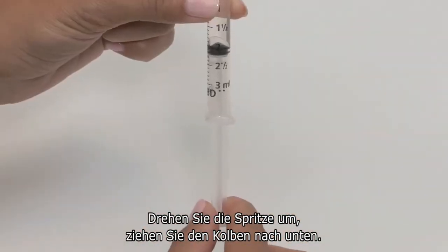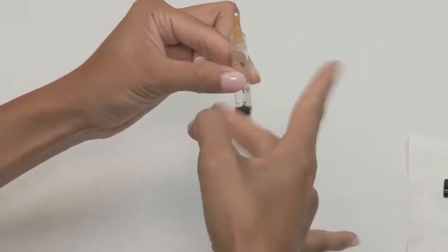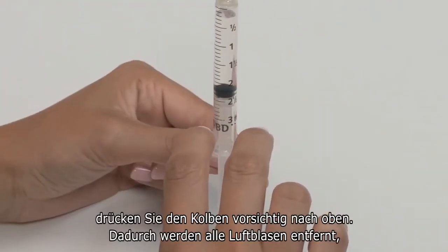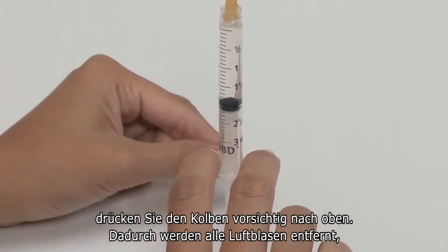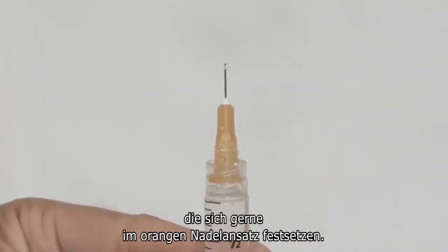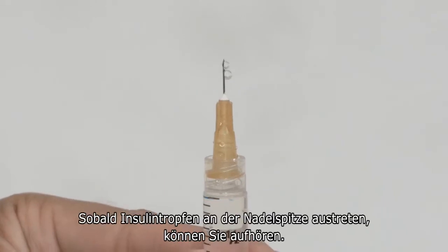Turn the syringe upside down and pull back some on the plunger. Flick or tap the syringe to release any air bubbles so that they rise to the top. Once you've gotten all the air bubbles loose, slowly press up on the plunger to remove the air from the syringe. A common place for air bubbles to get stuck is in the orange needle hub, so be sure to inspect that area. Stop when you see drops of insulin at the tip of the needle.